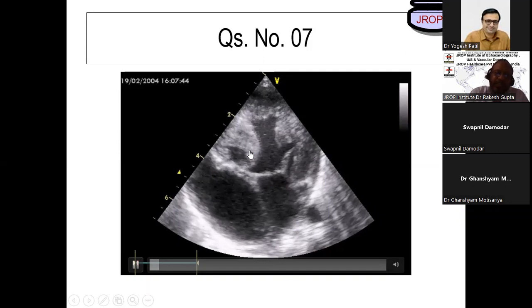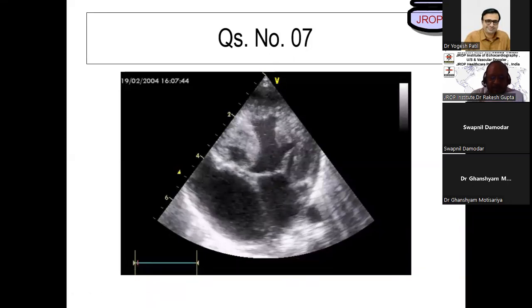So yes, there is no tricuspid valve, and tricuspid atresia is definitely present. But why do you see this RV then? There are two reasons for this RV. You get an additional 1 point. I have already mentioned 2 points addition. Okay.